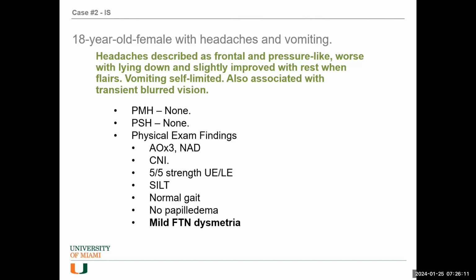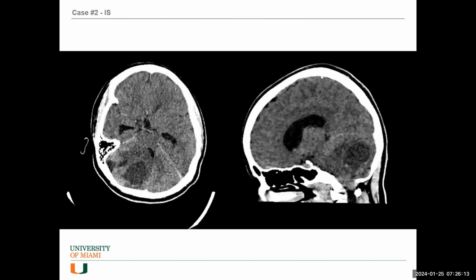So you get this call because you're on call. Jackson West does a CT scan and immediately sends you this. Okay. So exactly, right on the money. Which side would be more dysmetric, right or left? Should be right, because it's lateral. Perfect.